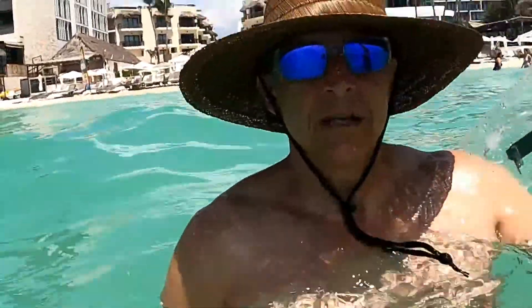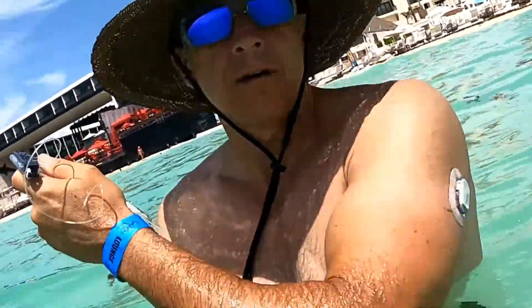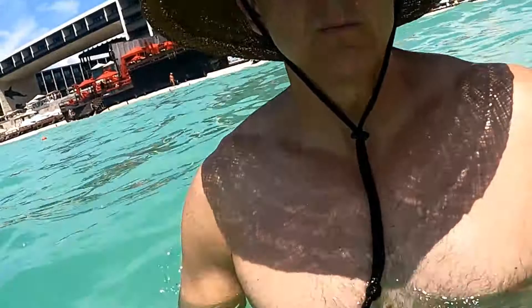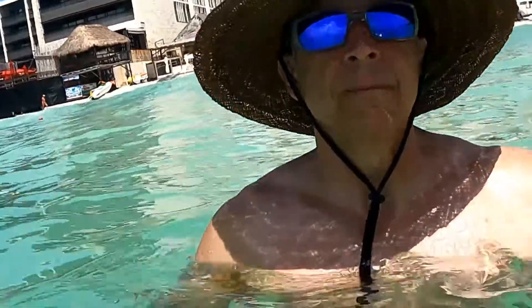Hey, how's it going? Jeff here, Type 1 Diabetic Out of Doors. Kicking it down here in Playa del Carmen. I thought I would do a test with the insulin pump, trying to make it waterproof. Obviously, I'm rocking the G6 CGM, and the idea would be to be able to wear the Tandem X2 Slim Pump with it.